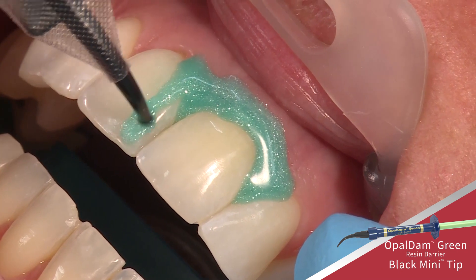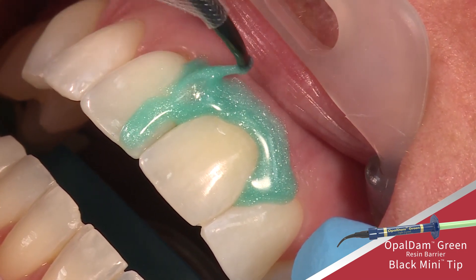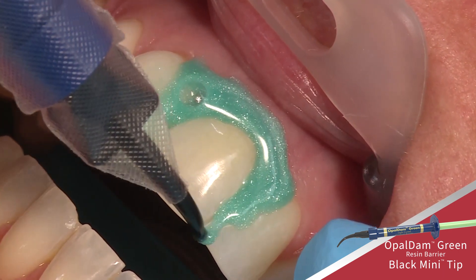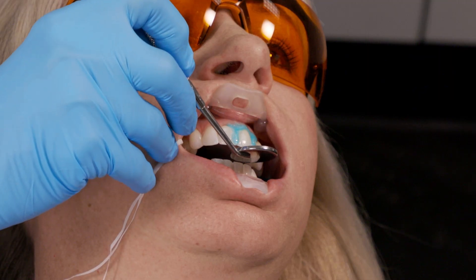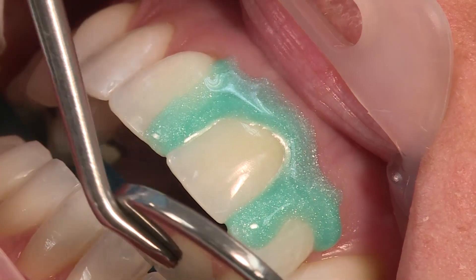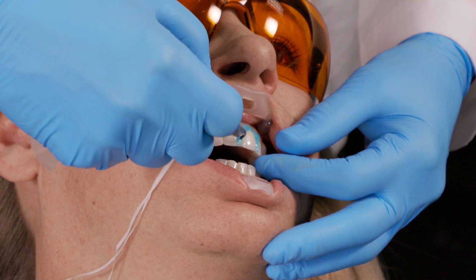Express a continuous bead of Opal Dam barrier along the gingival margin, overlapping approximately 2 to 3 millimeters onto the enamel. Extend the resin one tooth beyond the last tooth to be whitened. Using the mouth mirror, look up the long axis of the teeth for gaps or minute openings exposing underlying tissue and reapply resin.